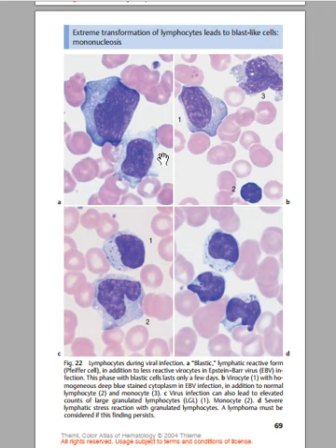You see, they are very large, with a very large nucleus, and that nucleus also has a greater part of euchromatin. Is it clear? So these are blast nucleus forms. Here they are also called the Pfeiffer cells. These large nucleus cells are also called the Pfeiffer cells, and these big cells like that are due to the infection with the Epstein-Barr virus.